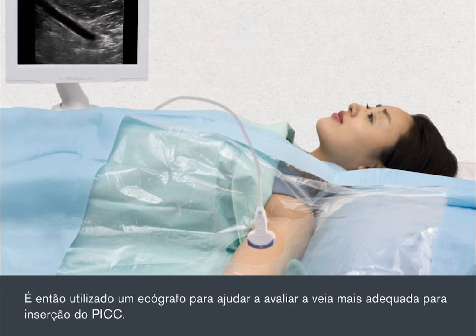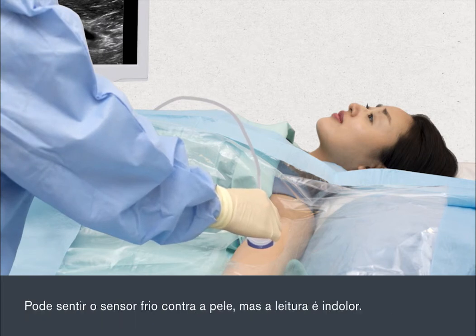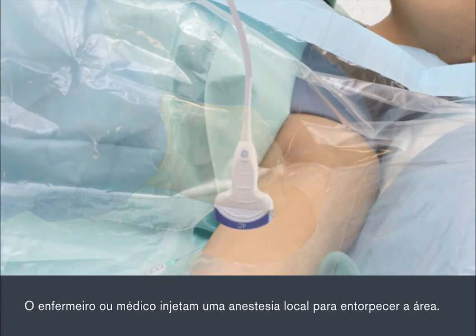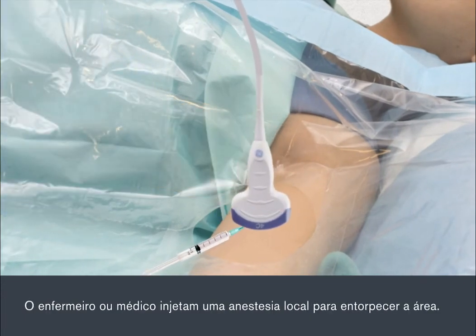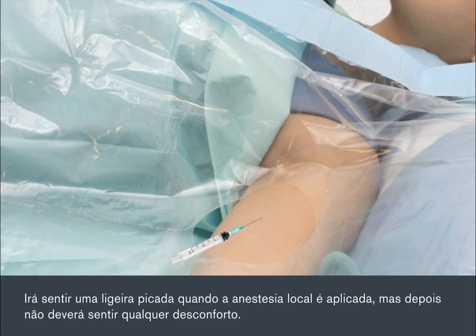An ultrasound scanner is then used to help assess the most suitable vein for insertion of the PIC. The sensor may feel cold against your skin, but the scan is painless. The nurse or doctor will inject a local anaesthetic to numb the area. You'll feel a slight sting when the local anaesthetic is applied, but after this you shouldn't feel any discomfort.